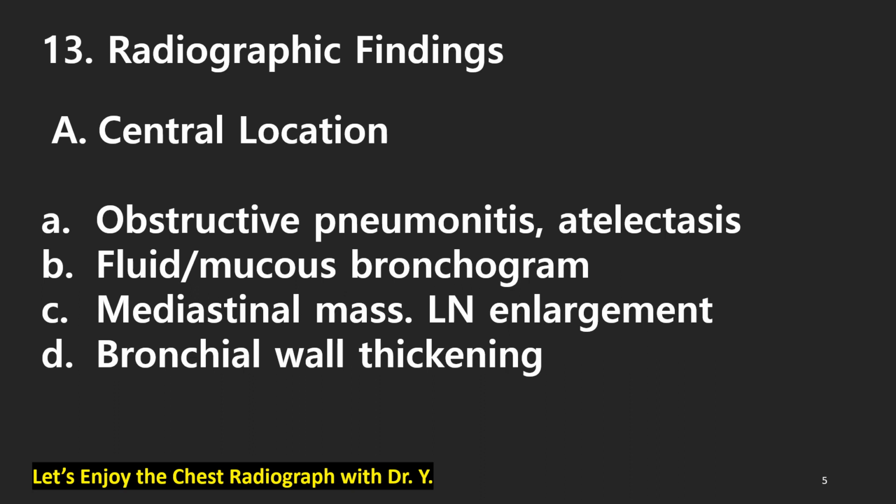Chest radiographic findings of lung cancer. They are usually divided by the location. First is central location. A. Obstructive pneumonitis or atelectasis. B. Fluid or mucous bronchogram. C. Mediastinal mass or lymph node enlargement. D. Bronchial wall thickening.